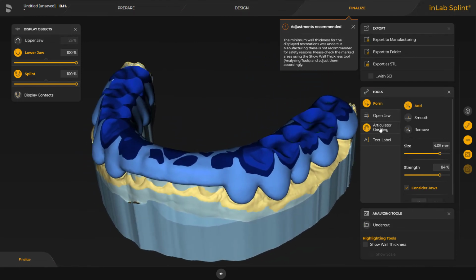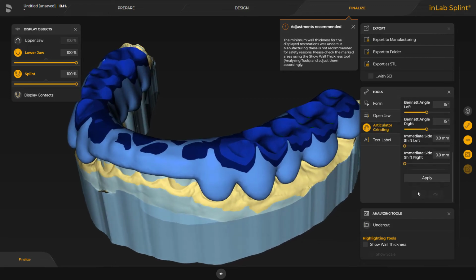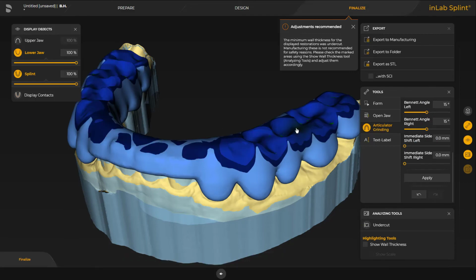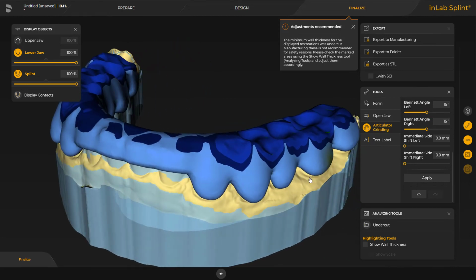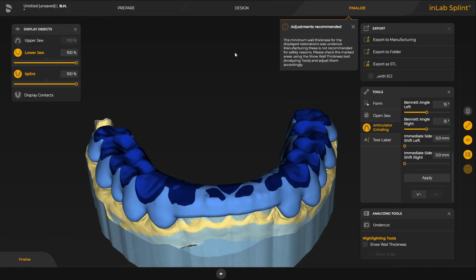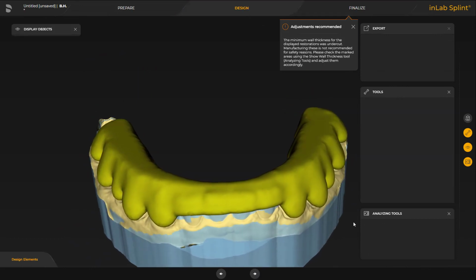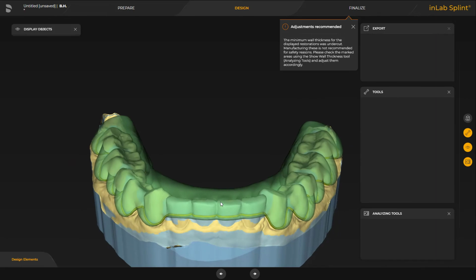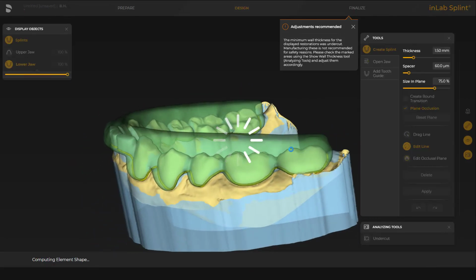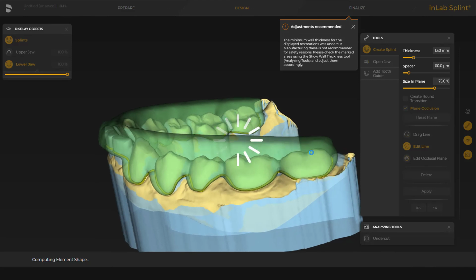I could also use grinding articulator, activate apply according to your articulation parameters, and now the occlusion changed a bit. So you could do it this way, or you do it on the manual part. So I'm just undoing my occlusal surface.